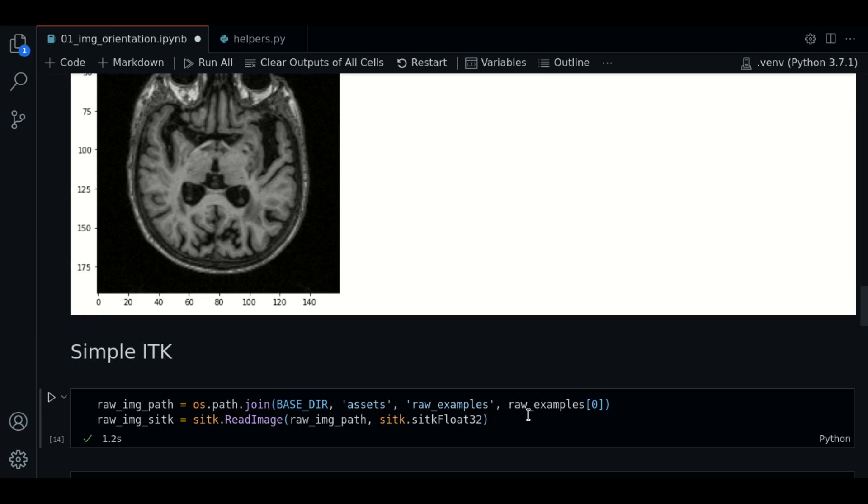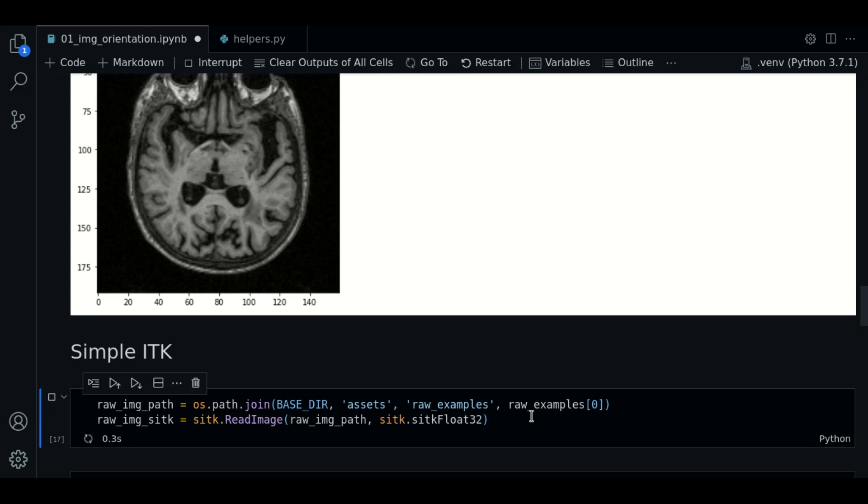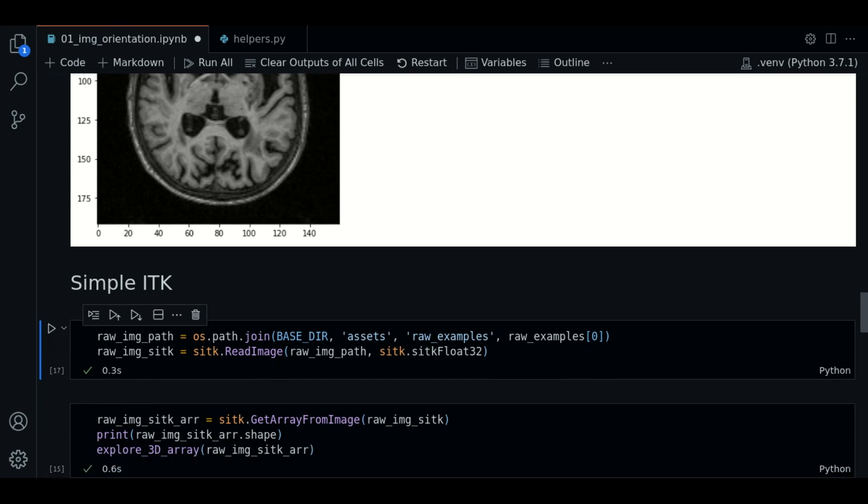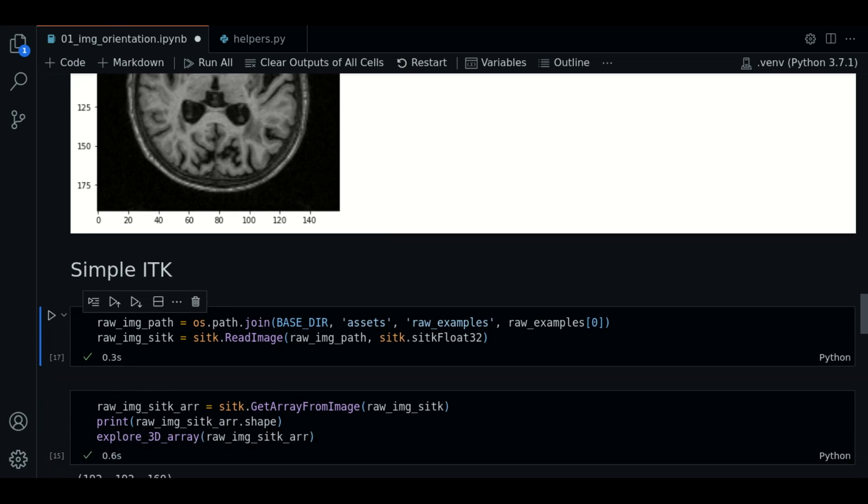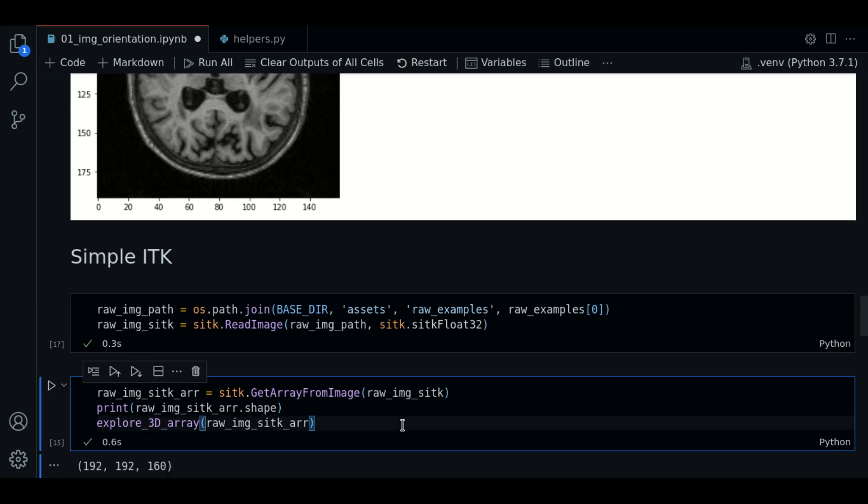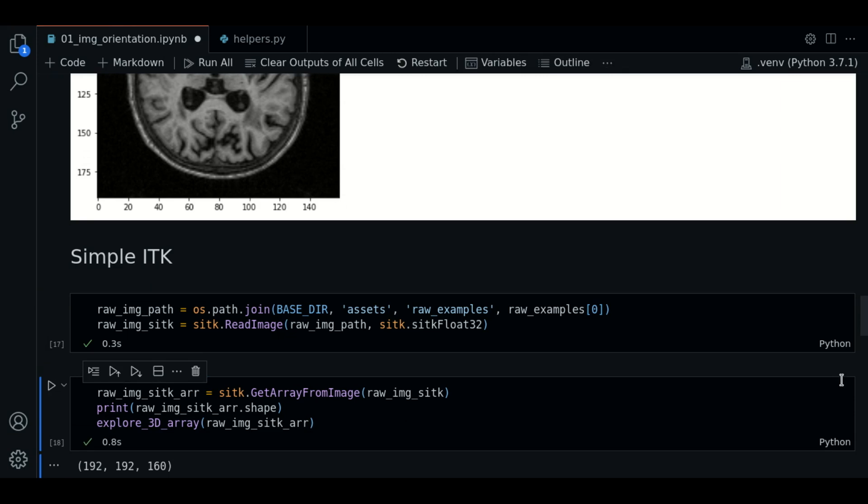So let's learn how to define the orientation string using SITK. We start by loading a raw example using SITK this time. First, let's plot the image.